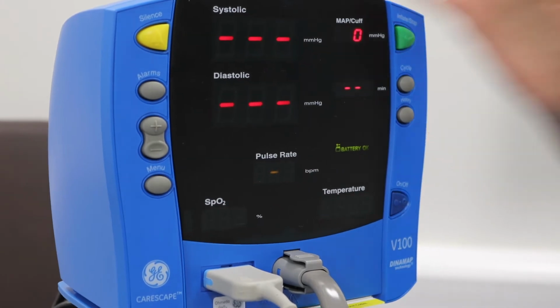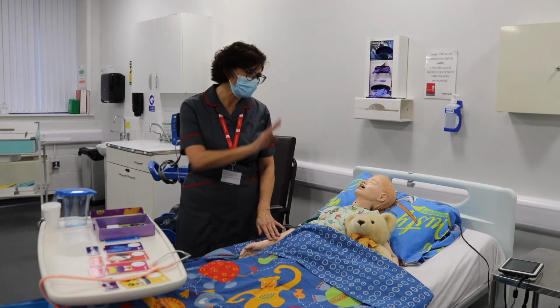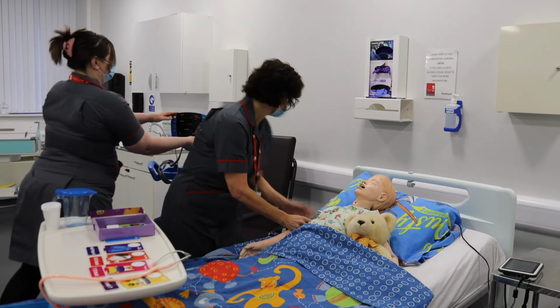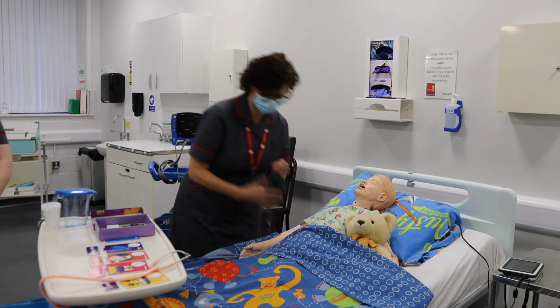Press the button and that should inflate. Okay, Sam, it'll be done in a second. That's then complete, and again the results will pop up on the screen to the left. Thank you. I'll just take this cuff off of you now, Sam. Thank you very much.